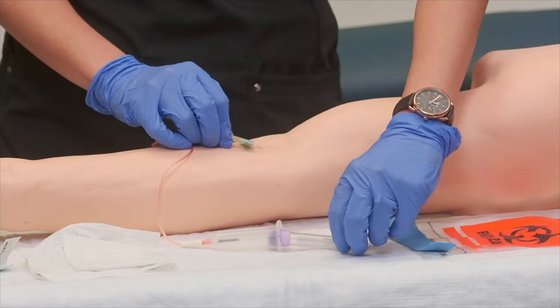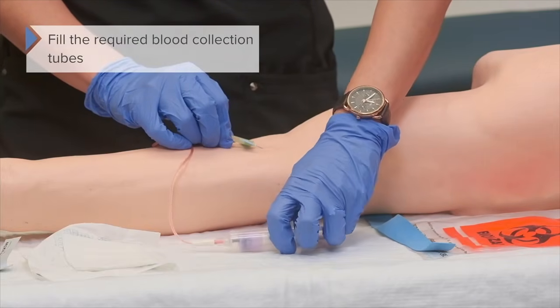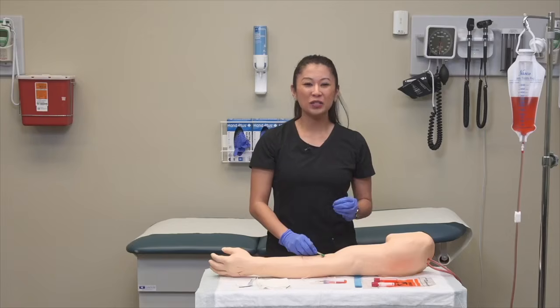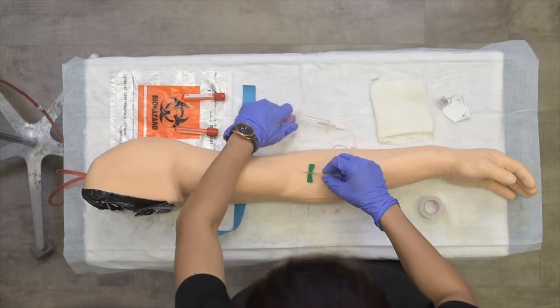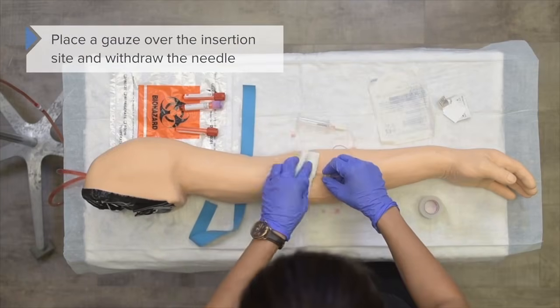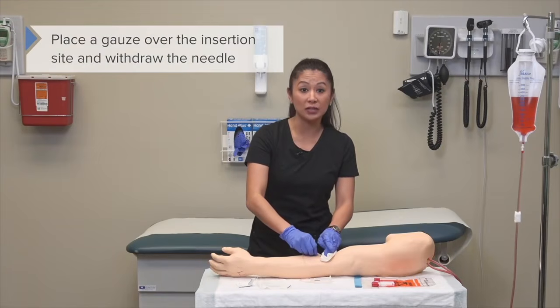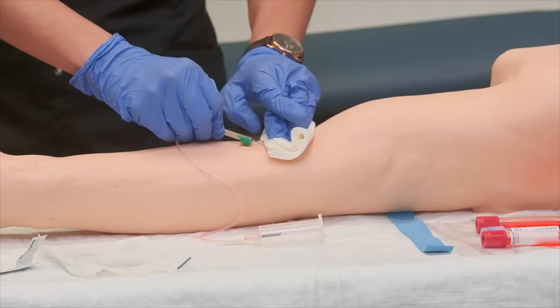And then again, going to stick it here, push this in all the way till it punctures, and then make sure that fills appropriately. Now once we've got our blood collection tubes, then we can go ahead and remove these and then place the gauze over the insertion site. Now once we do this, we want to go ahead and withdraw the needle. So once we withdraw the needle, go ahead and pull this out.